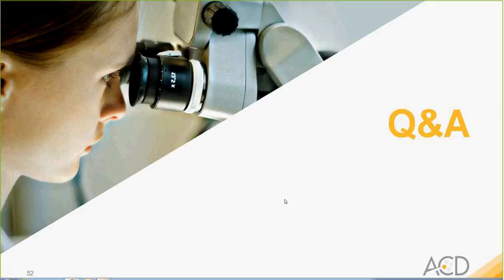Many of our customers have been successful in running dual IHC and RNAscope assays using different chromogens, and they've had excellent results using the two modalities together. We can point you to some papers and provide some advice on how to approach those dual assays if you contact our customer service group.